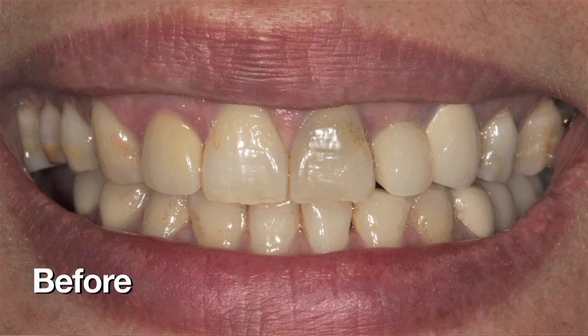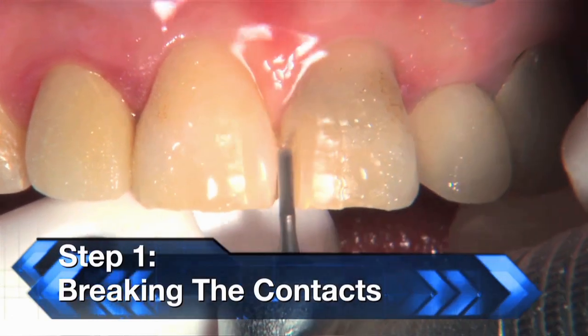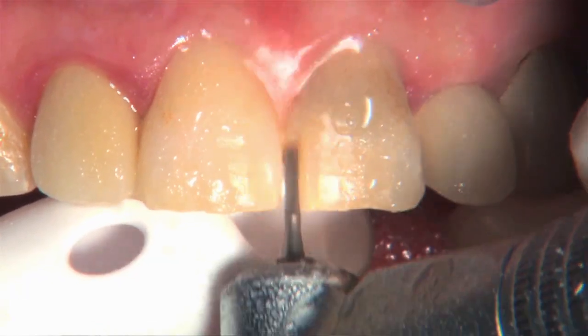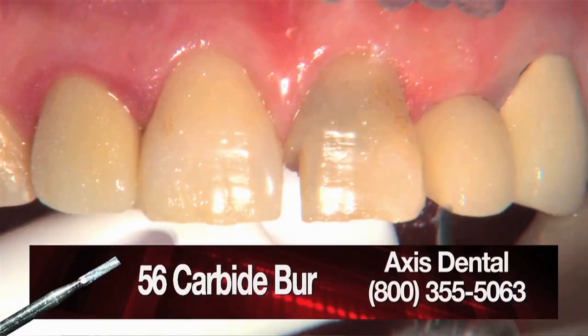So this is actually going to be the first Bruxer anterior crown that I did from about a year and a half ago, and it'll be interesting to see how it blends in with the rest of the teeth. So step 1 of the reverse preparation technique is to break the contact. Again, we're going to take a 56 carbide, 57, anything that's not cross-cut, and we're going to use it on the mesial and distal to break those contacts.